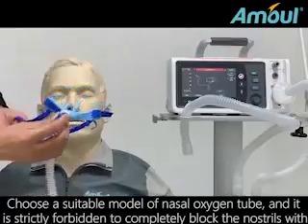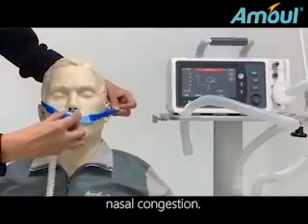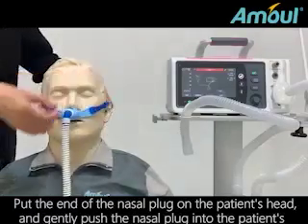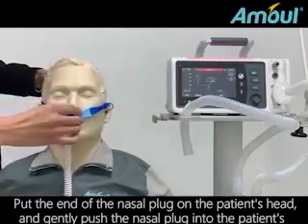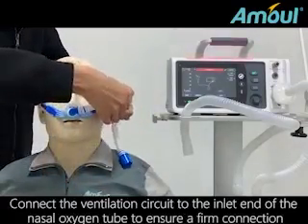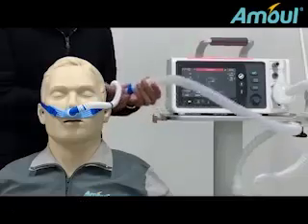Choose a suitable model of nasal oxygen tube, and it is strictly forbidden to completely block the nostrils with the nasal plug. Put the end of the nasal plug on the patient's head and gently push the nasal plug into the patient's nostril to adjust the tightness. Connect the ventilation circuit to the inlet end of the nasal oxygen tube to ensure a firm connection.